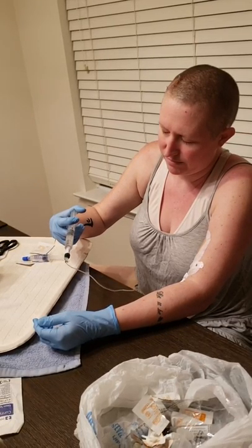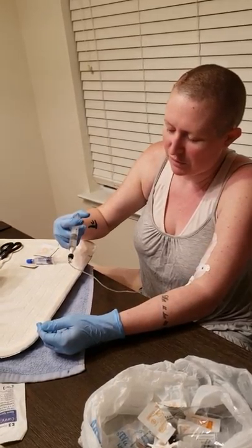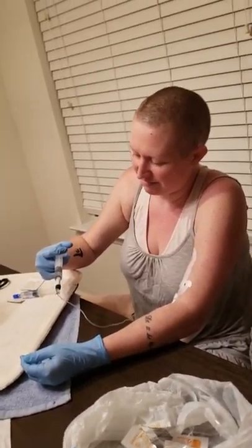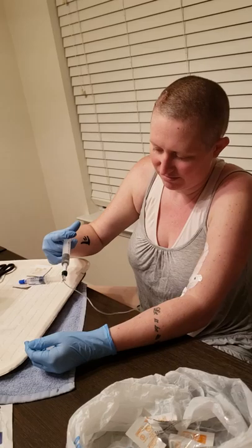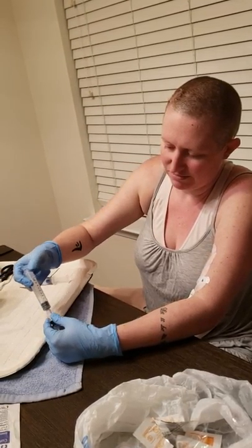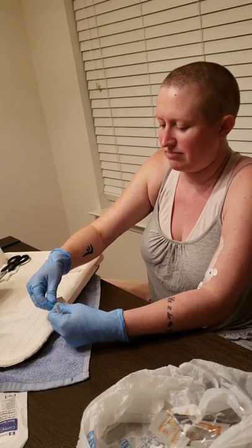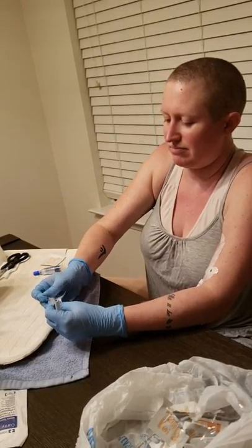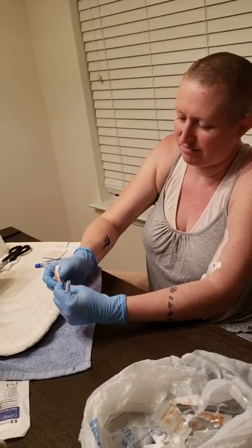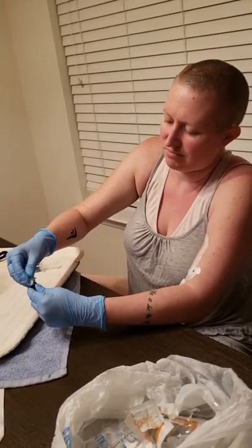This one just goes in at a steady rate again — not fast, not slow. Probably slower with my hands because they're smaller. The last thing she's going to put in is heparin. It's a blood thinner. You've got to keep that catheter — or a simpler term, tube — in her vein from clotting, especially at the tip. That's what the heparin flush is for.